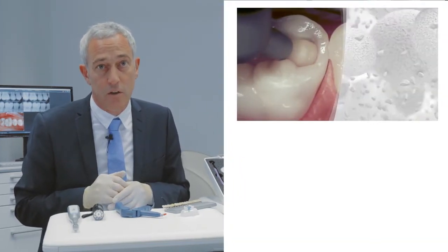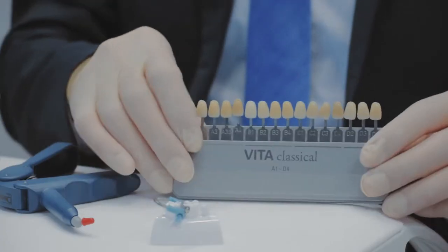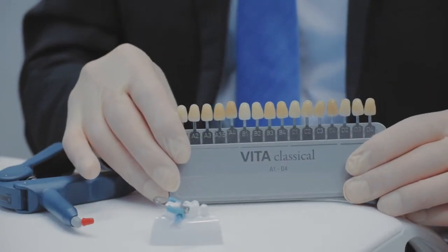With CeramX, DENTSPLY Sirona offers a composite with a brand new and revolutionary SphereTech filler technology. The spherical shaped filler particles in CeramX are responsible for the outstanding handling characteristics of this composite. It adapts perfectly to all cavity walls and does not stick to the hand instruments. Besides great handling, CeramX is the only composite on the market that can cover the 16 shades from a Vita shade guide with just 5 shades.